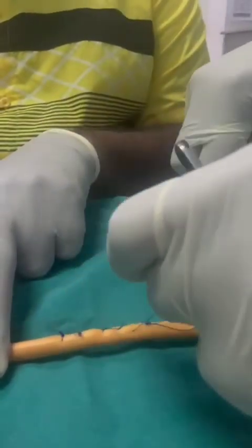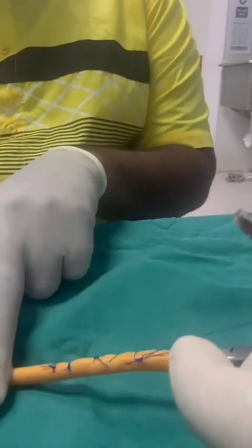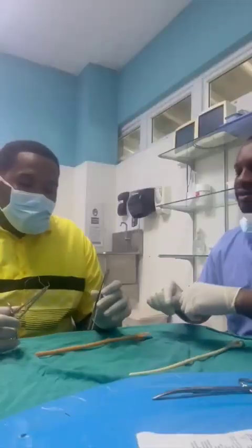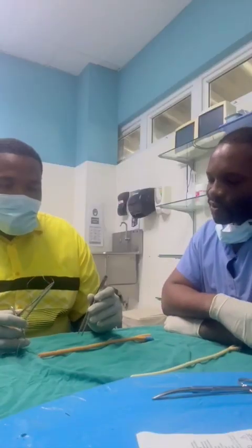Any questions with the interrupted sutures or the continuous suture? No. Okay, very well. Then I cut the knot 1 centimeter from there. So, Dr. R, I would like you to demonstrate for me that you understand. Can you perform the interrupted suture for me?